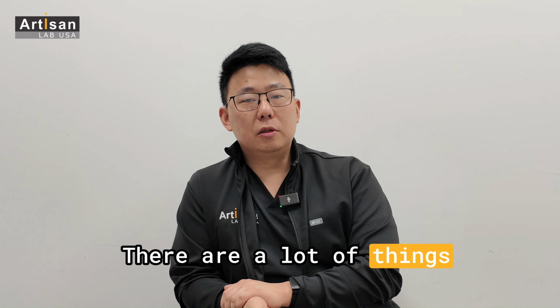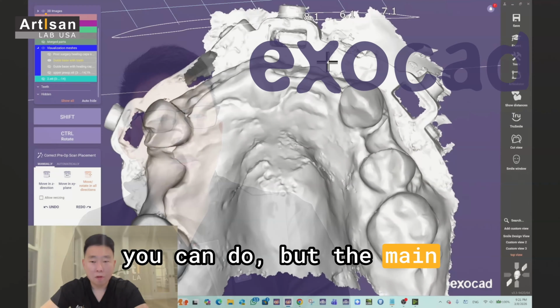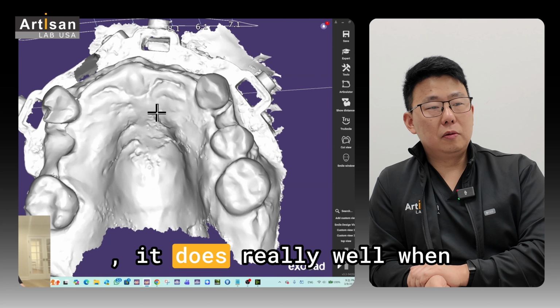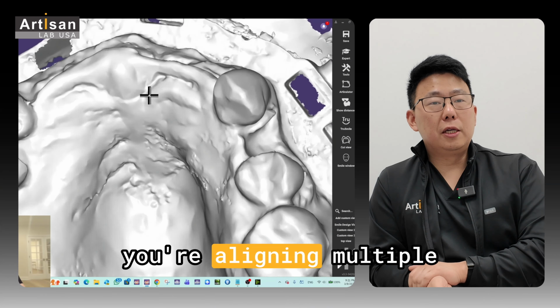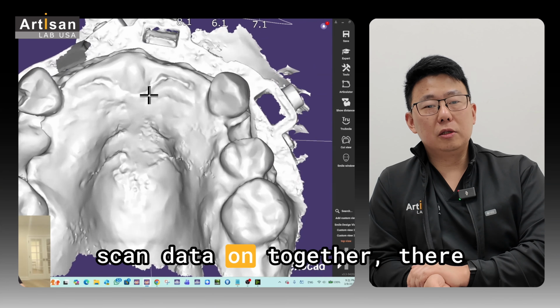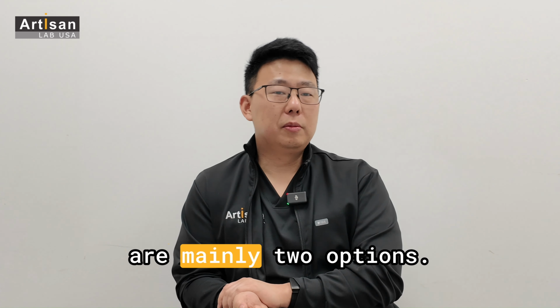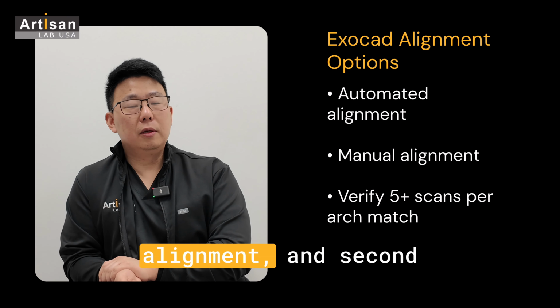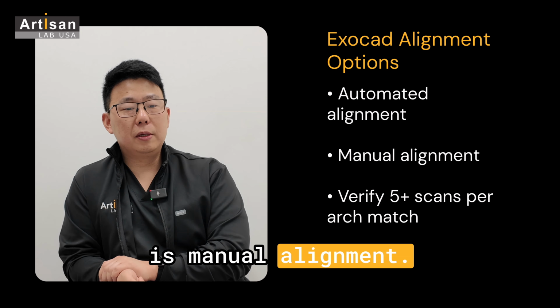There are a lot of things you can do, but the main strength of exocad is that it does really well when you're aligning multiple scan data together. There are mainly 2 options. The first one is automated alignment, and the second is manual alignment.